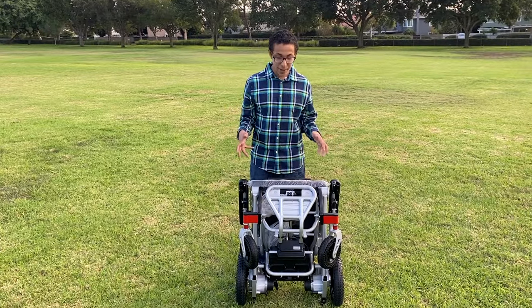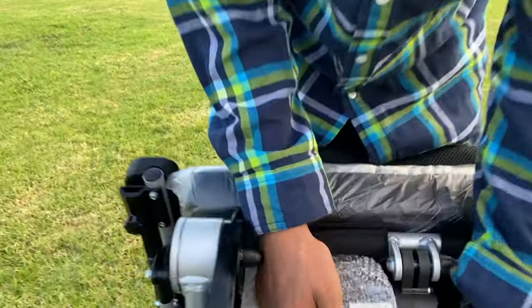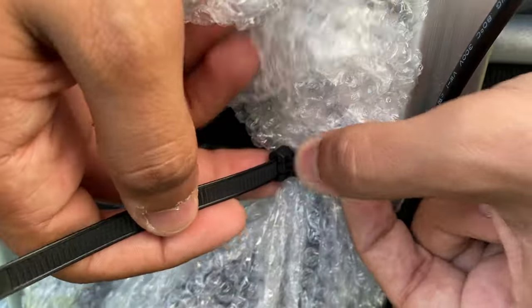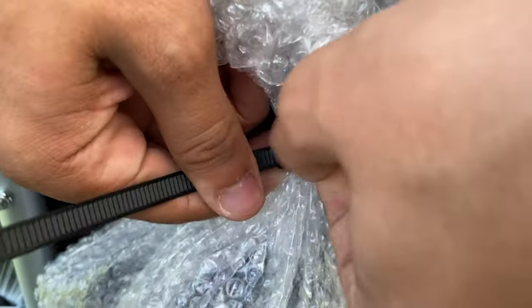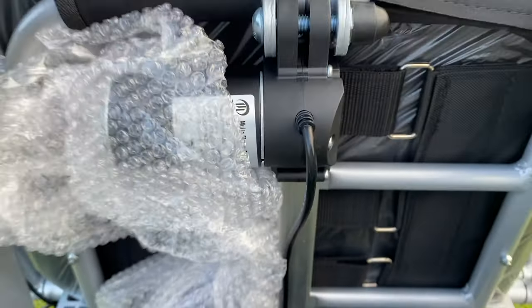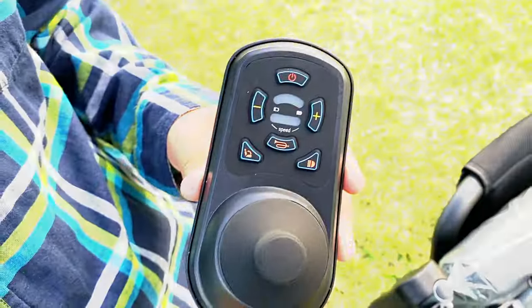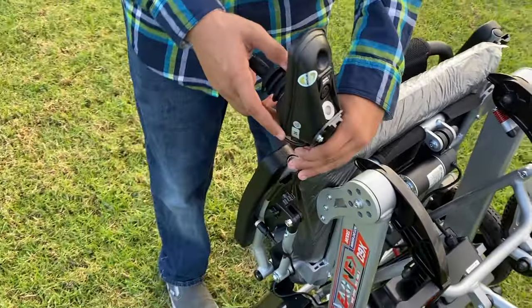You will take off your bubble wrap and come to your joystick. You'll see the tie cable right here — press this down and untie it. Then take out your joystick and put your joystick on the armrest.